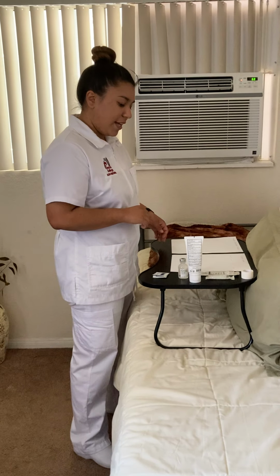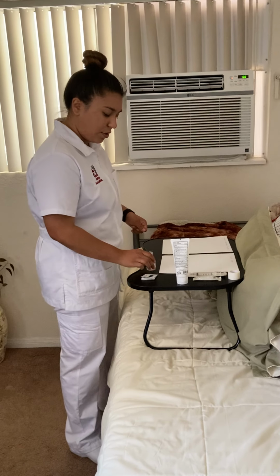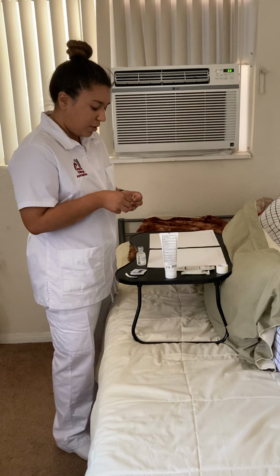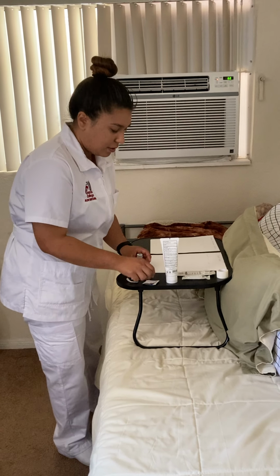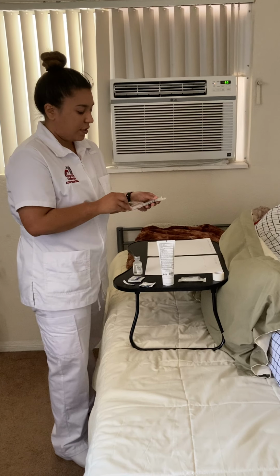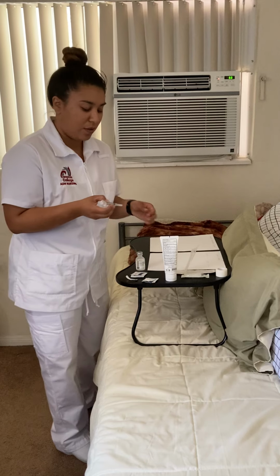So now that I've done that, I'm going to go ahead and draw up the medication. So I'm going to go ahead and clean the top of the vial with an alcohol swab. And then, so for this checkoff, I'll say I'm going to be giving the COVID-19 vaccine, 0.5 ml.